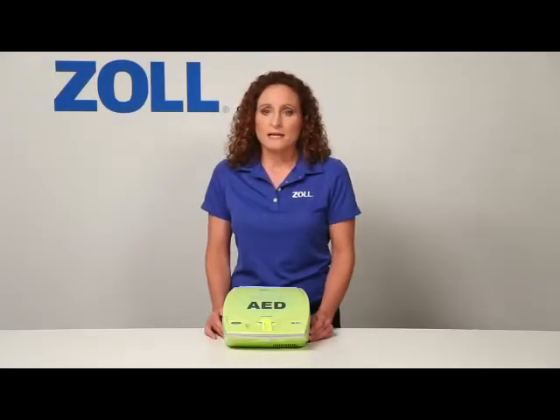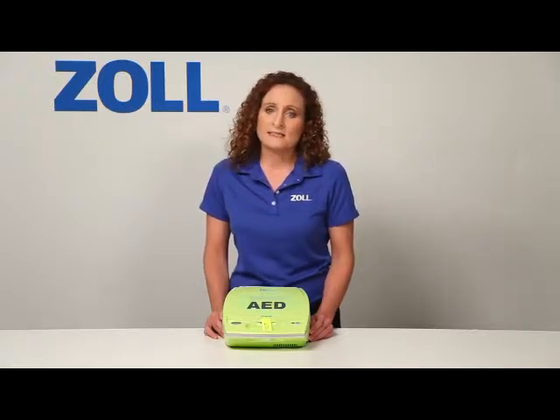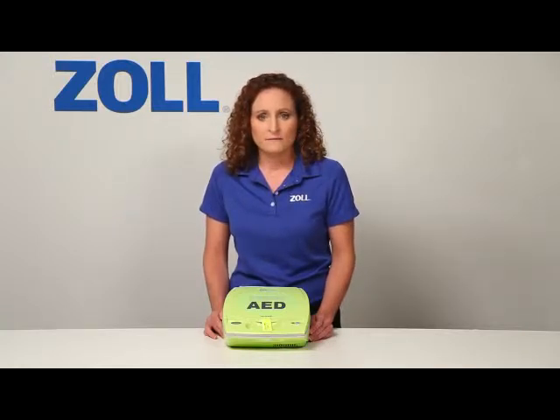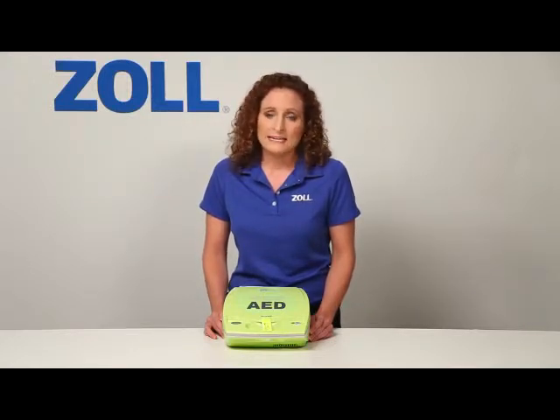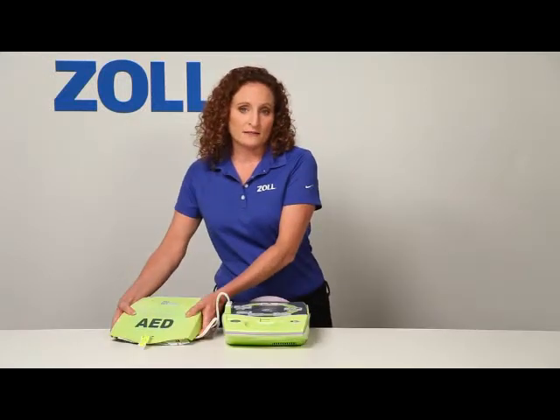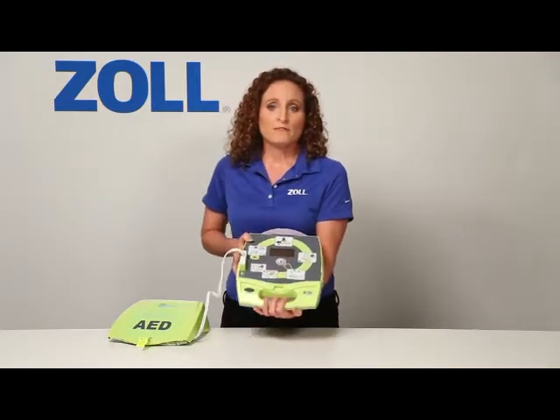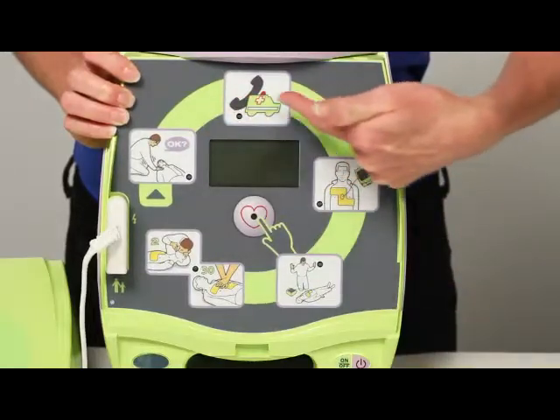Now let me demonstrate the major benefit of the AED Plus. It provides the best support to someone who is rescuing a victim of sudden cardiac arrest. Most of what I will demonstrate is not available in any other AEDs. Here we have several graphical icons. When I turn on the AED Plus, it will provide an audio prompt and light the icon for each of these rescue steps.